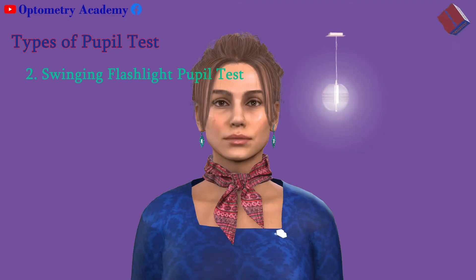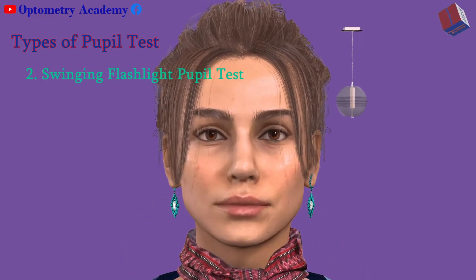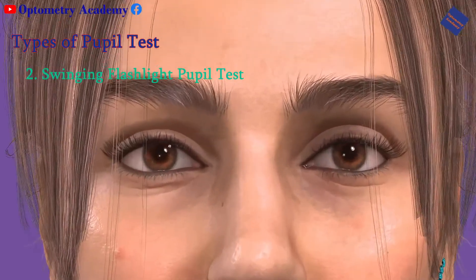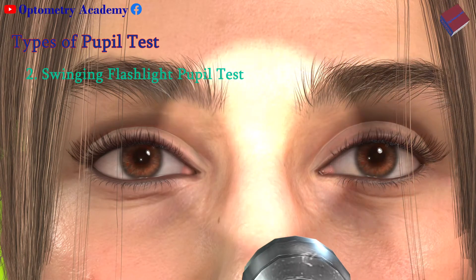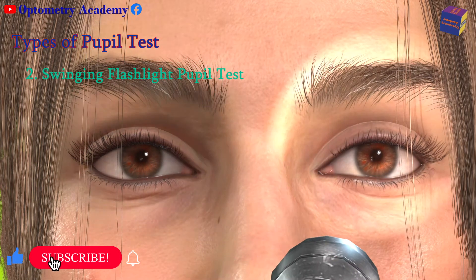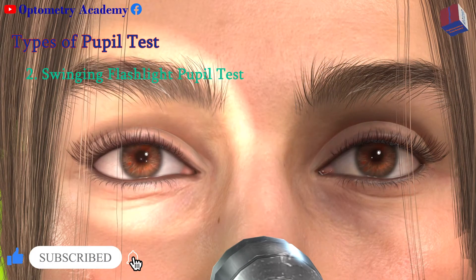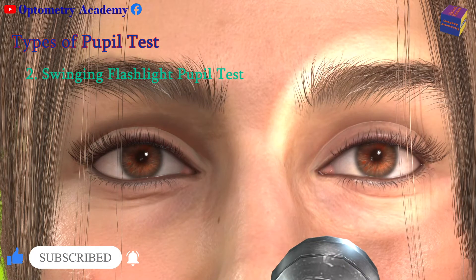Swinging flashlight pupil test: This test compares the response of your pupils to light. The light in the room will be dimmed and again you will be asked to look at a far-away object. The eye doctor will swing the light from one eye to the other in a rhythmic motion, recording the responses of each pupil. When the light is shown on your pupil, they should constrict or remain the same size.